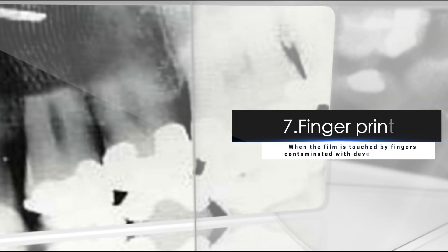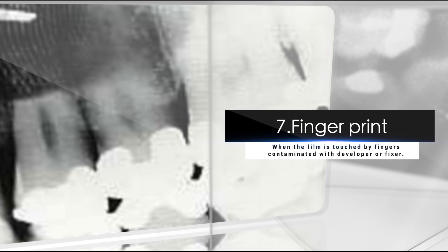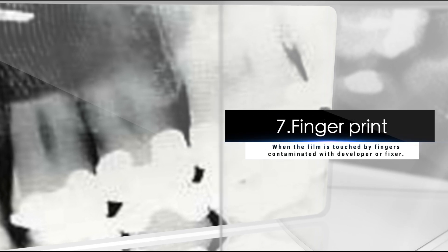Seven, fingerprint. When the film is touched by fingers contaminated with developer or fixer.